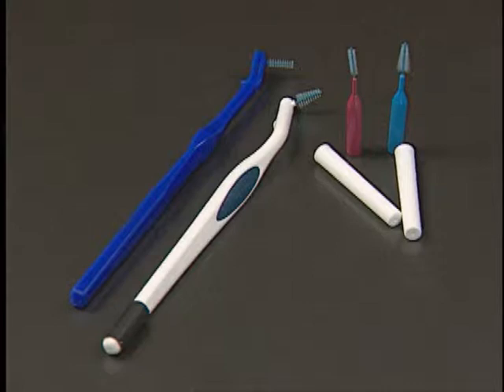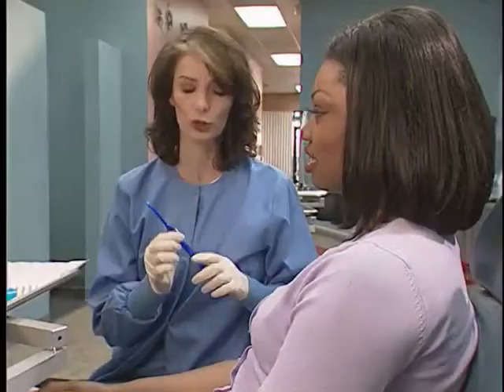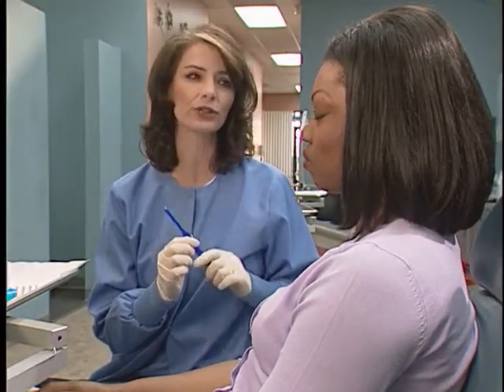You can buy these in the oral hygiene department at most drugstores or large discount stores. Now, use your interproximal brush at least once a day, and you might even find yourself using it more often. And remember, this is in addition to flossing.